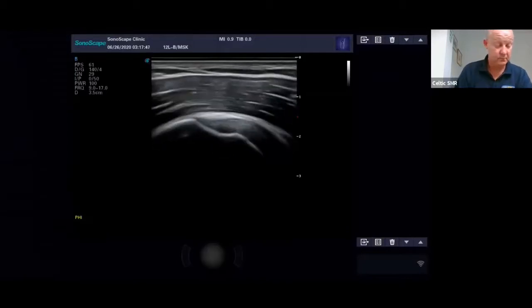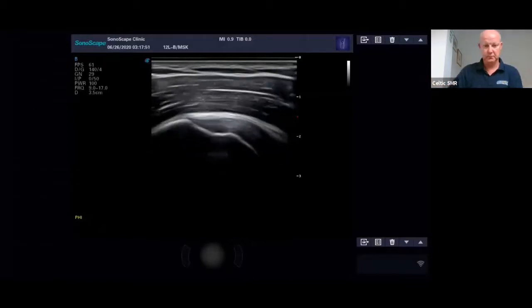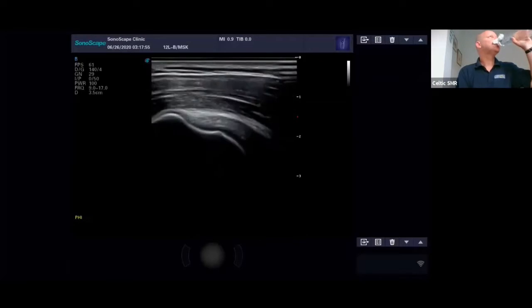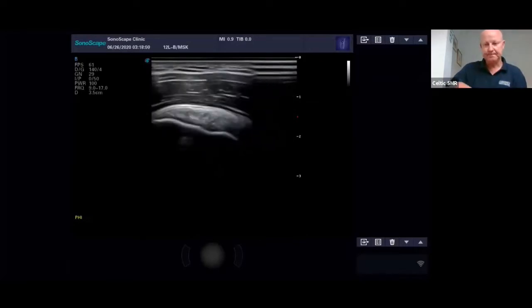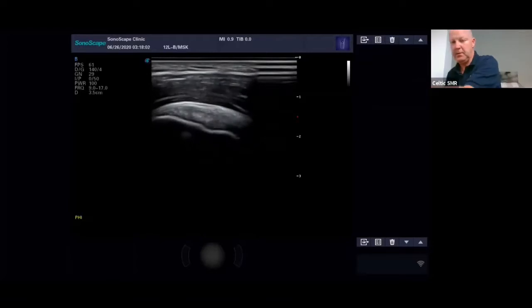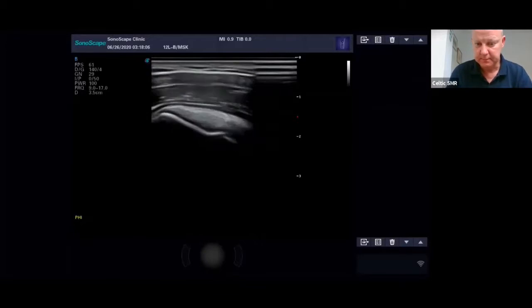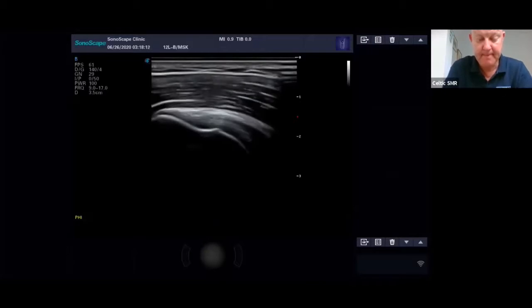Now, as I say, these tendons blend into one another, so it's quite difficult to spot where they merge. But if you keep scanning out laterally, eventually you'll see that slope off, and that means you've gone over the facet, and now you're on the infraspinatus. So that is actually infraspinatus, and then back onto the supraspinatus. So you can see you can't actually differentiate them very well.